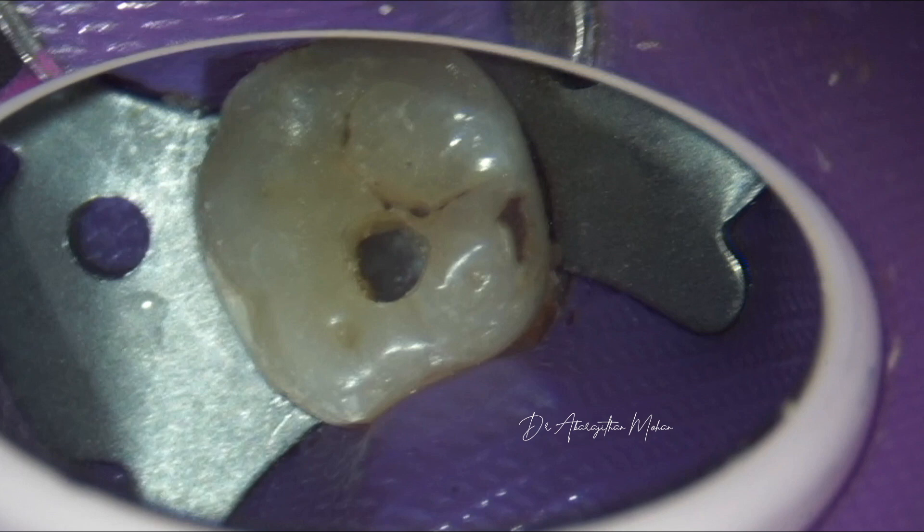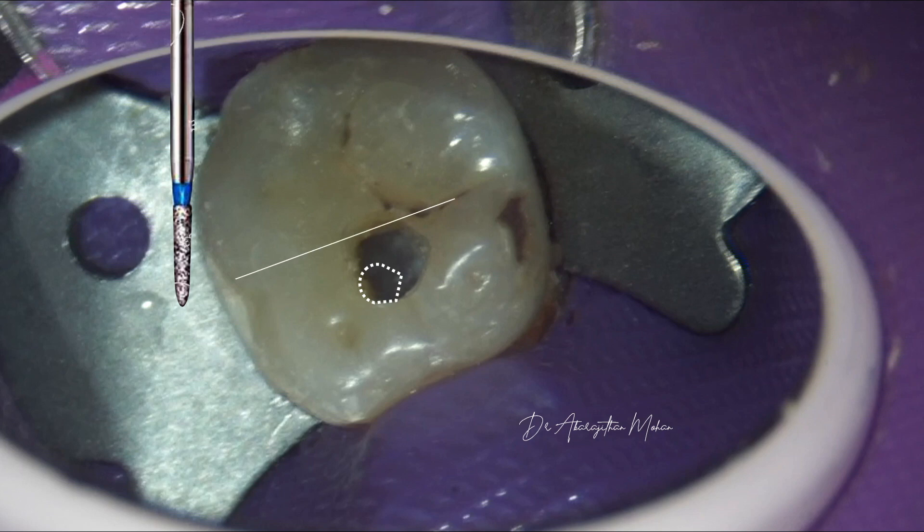This is the initial access prepared with a traditional tapered diamond bur. The point of entry is the inner slope of the mesiobuccal cusp, where the height of the pulp horn is maximum and is the easiest point of entry. Following this, we make sure the access doesn't extend beyond the central point and doesn't undermine the lingual cusp.